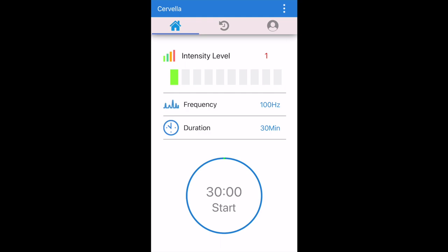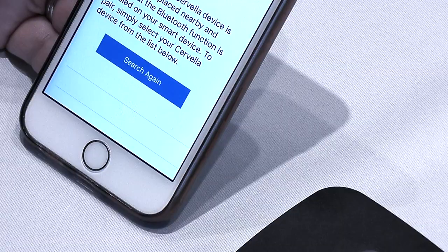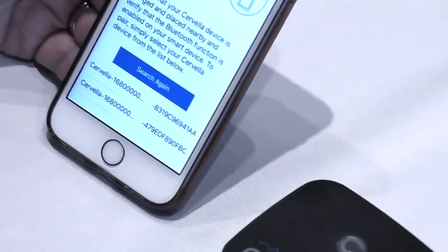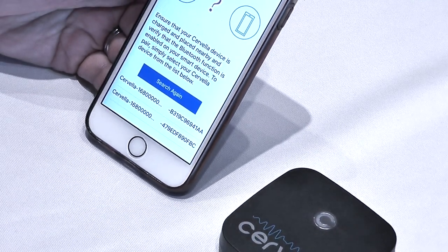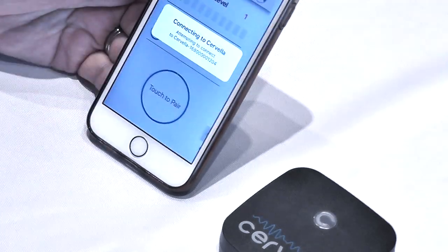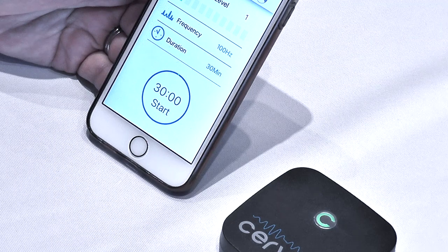Select your Cervella device and the LED on the Cervella device should turn on green. Note: the app always searches for the closest Cervella, so if there are multiple Cervella devices in the area, the closest to your smart device will appear on top of the list.